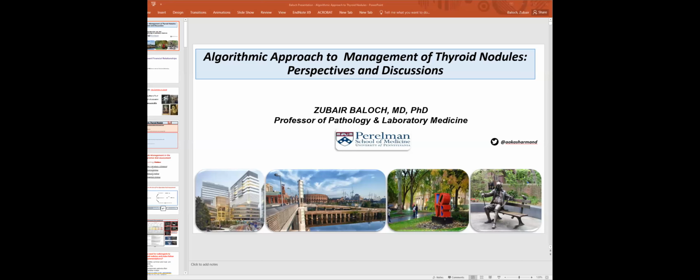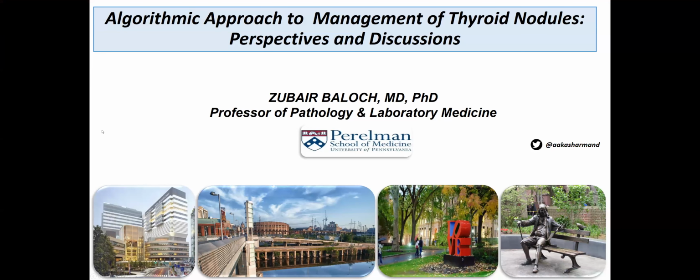The surgical pathology one I am going to handle mostly by going through some of the cases, and in the discussion, I will also focus on the new WHO classification scheme. Having said that, let's start with the first presentation, which is about the FNA. I'm going to give you perspectives on what I think is important to know, and that will go beyond the morphology.